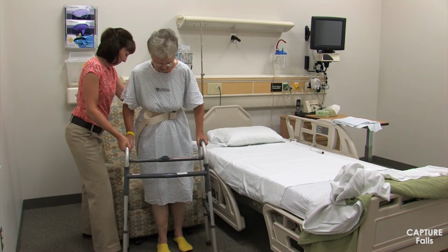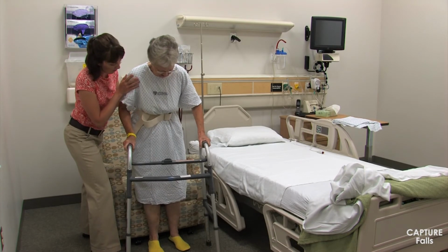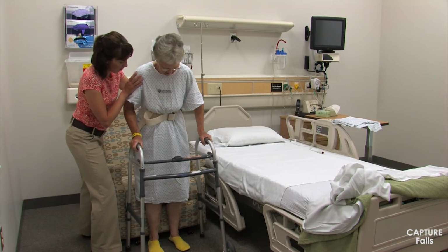She should also move the walker along with her, keeping her feet inside the walker as she turns. Move along with the patient as she turns, staying along her side and keeping one hand on the gait belt and the other hand near or lightly touching the trunk or assisting in moving the walker. You'll notice in the video that I switch sides in order to stay close to the patient but not get stuck between the patient and the bed.